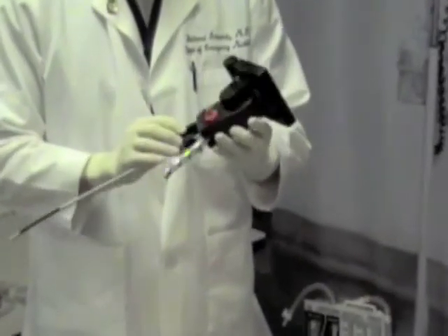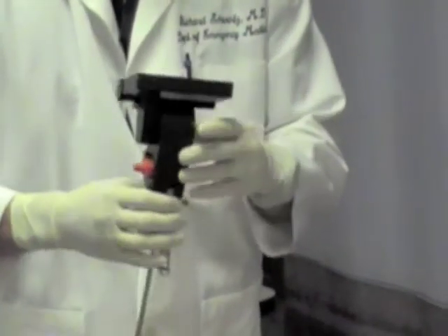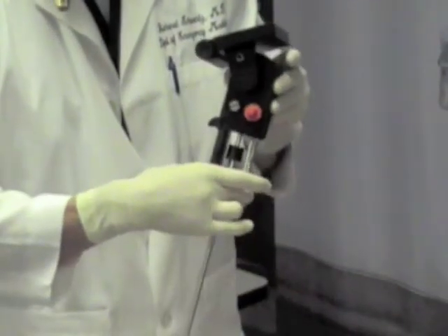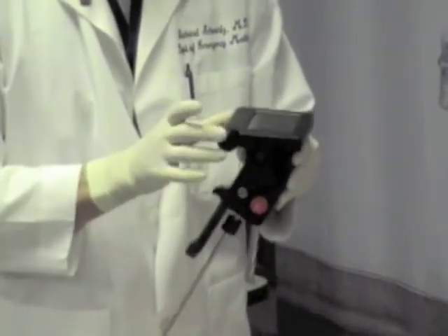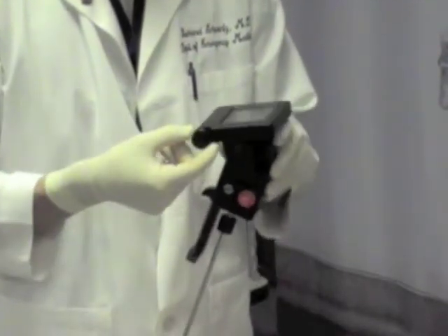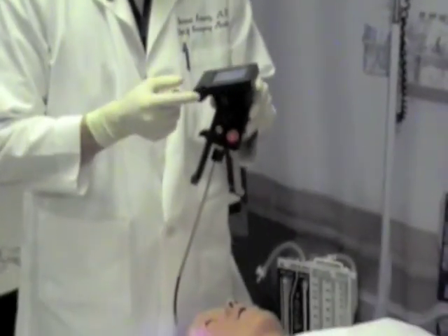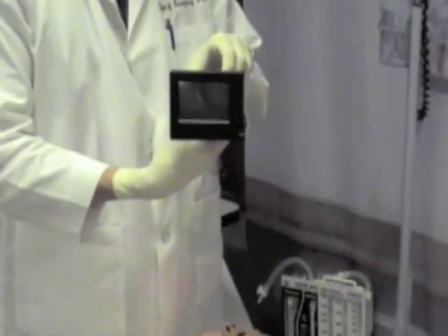This is the Video Rifle Scope. It is a stylet video scope that functions by articulation of the stylet utilizing a video screen. You may notice there is no on-off switch. The on switch for the device is a simple turn of the battery cover, and you'll have an image come on the screen.